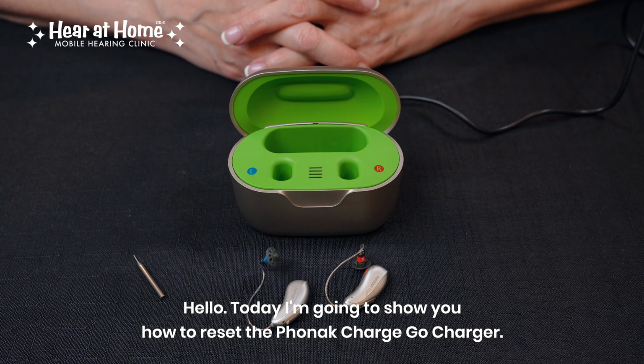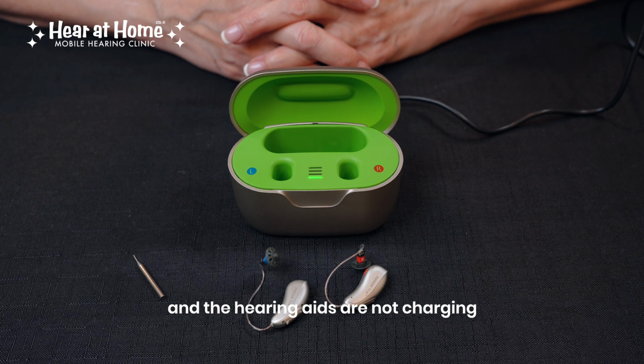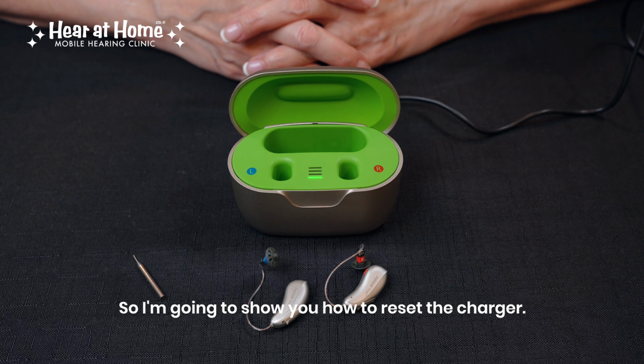Hello, today I'm going to show you how to reset the Phonak Charge Go charger. If for some reason the charger is causing you difficulties and the hearing aids are not charging, or you're getting inconsistent lights on the Phonak Charge Go, we may ask you to reset the charger. So I'm going to show you how to reset the charger.